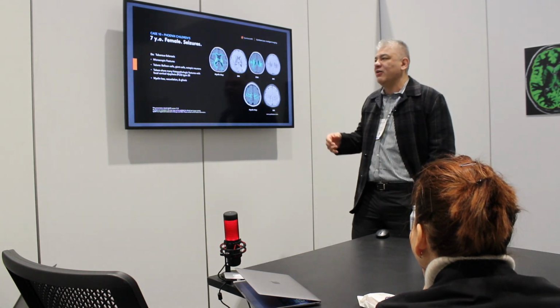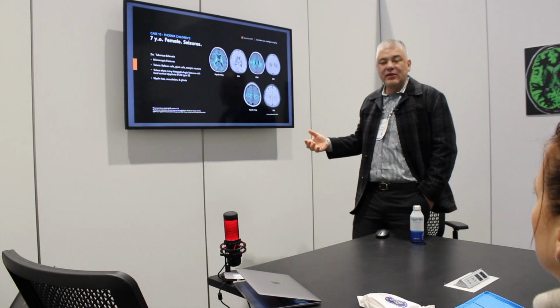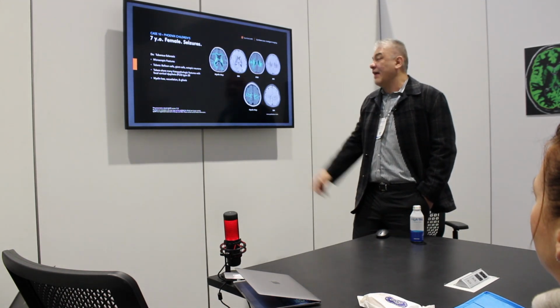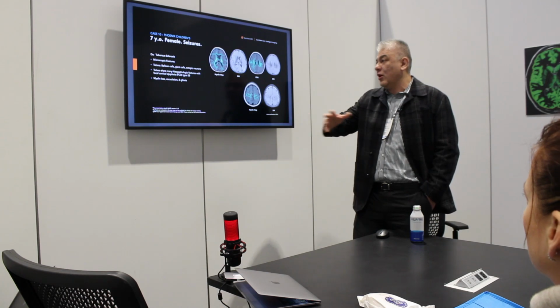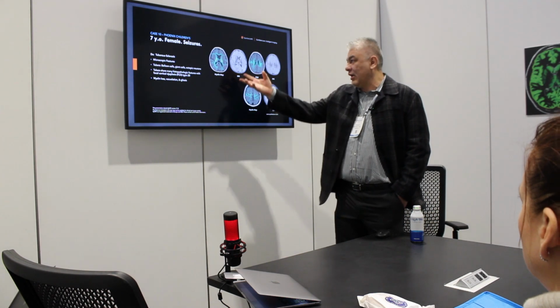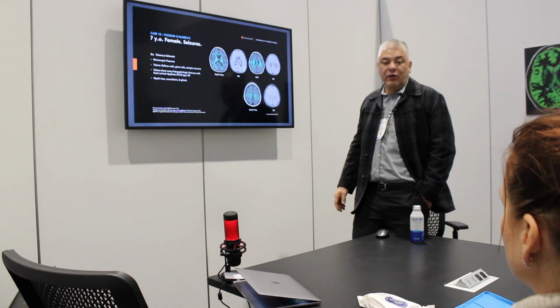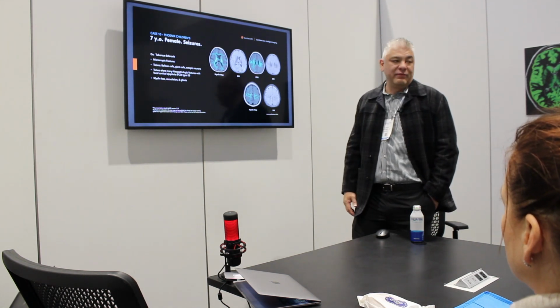So we see a common pattern of things that we haven't been describing before in all these patients with debilitating diseases, neurofibromatosis, now tuberous sclerosis, where we can objectively say and follow up in time in these kids, yeah, there is a decrease in myelin and now it's progressing. So I think it's a great tool, and I haven't done any research on it, so I don't know how it will progress over time, but I think it's something that I see in my clinical practice that I can objectively see that it's worth considering and mentioning always that we haven't been talking about before.